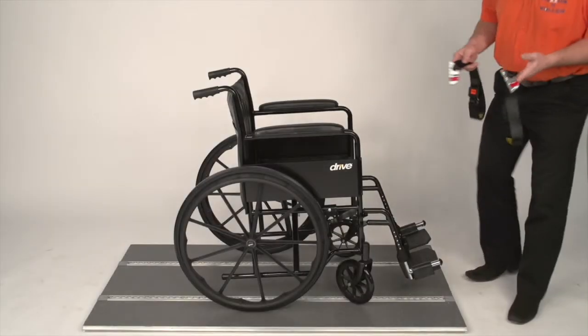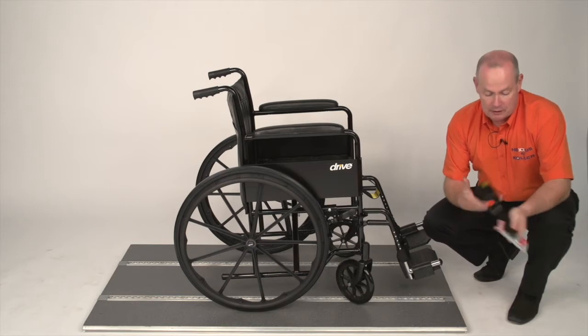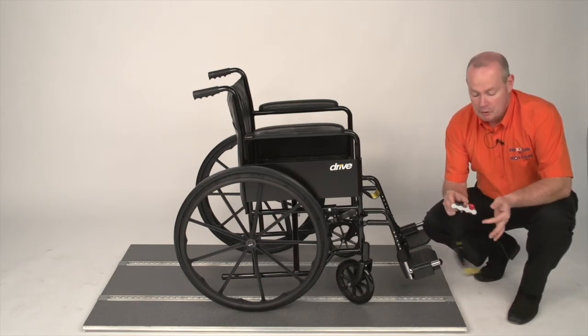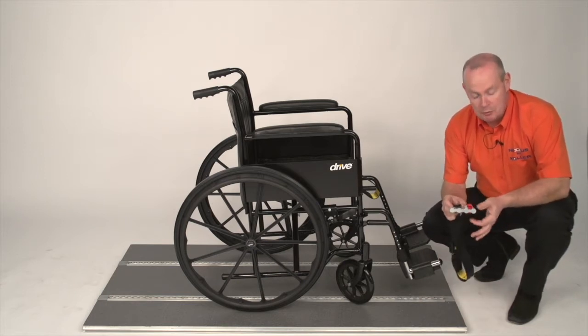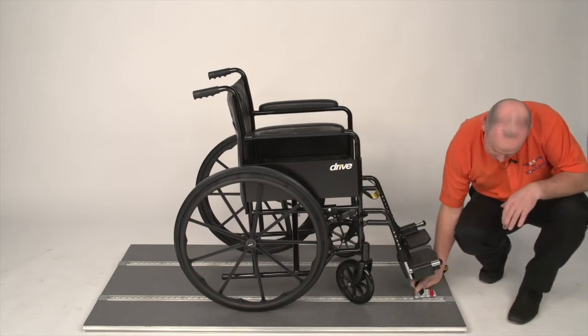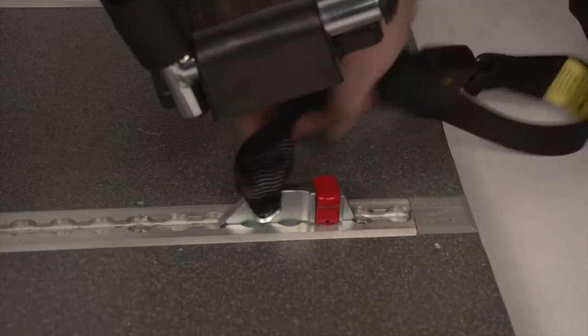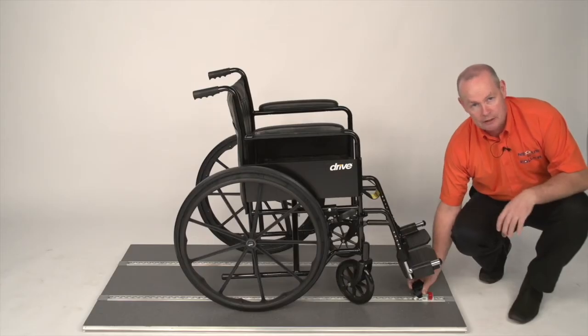We're going to start off by securing the wheelchair using the front straps. The front straps are webbing with a buckle, tongue, and a clip on the bottom. When you put the clip into the track, the most important thing is you don't touch the red plunger. You put the clip into the track by tipping it slightly forward, pushing down — the plunger will lift up, go forward, and you'll hear it click.